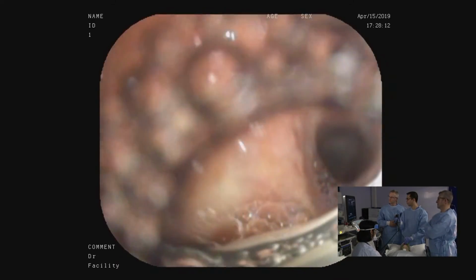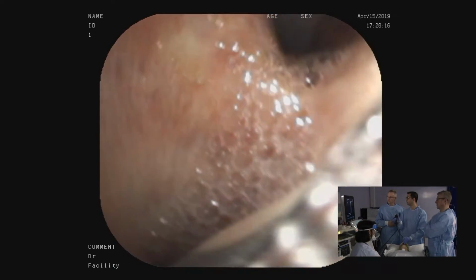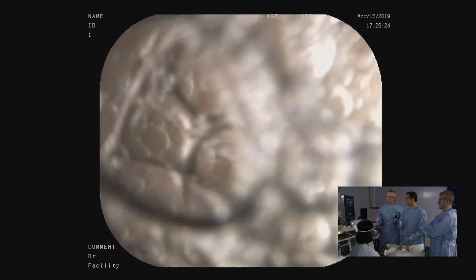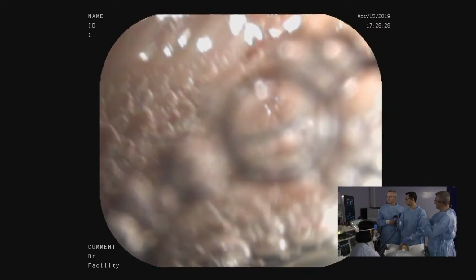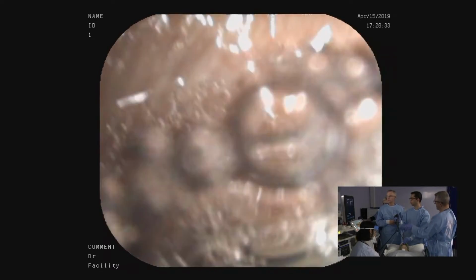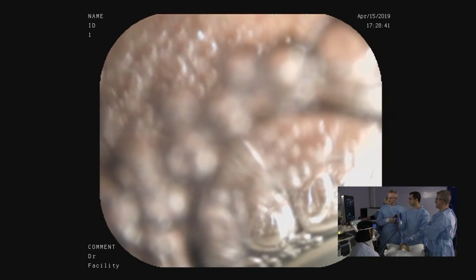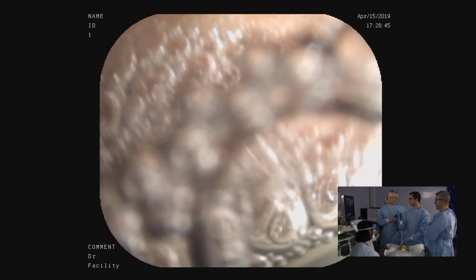If I come up, you can see I'm now in the trachea. So you go clockwise, that is the carina, touch it, and 1 cartilage interspace below, and that's it, inserting the bronchoscope through. So you're just in the proximal left main bronchus, and rotate about 90 degrees clockwise this time. Oppose the probe on the mucosa wall, and you should pick up the 3 o'clock position. And the name of this node? It's the subcarinal node, this is station 7. Okay, perfect.